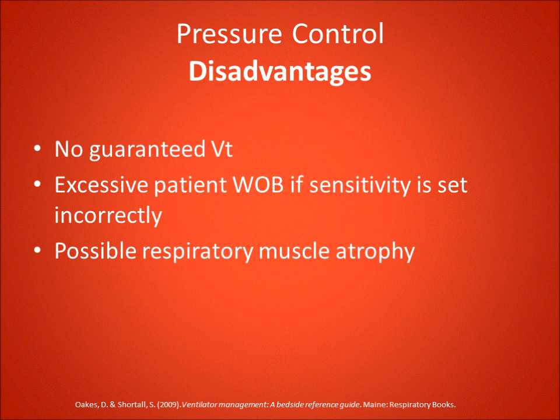The disadvantages of pressure control are there's no guaranteed tidal volume. It can cause excessive patient work of breathing if the sensitivity is not set correctly. And also there's a possibility of respiratory muscle atrophy.